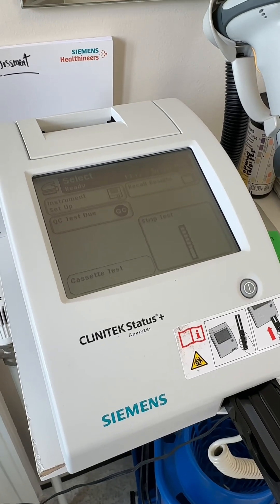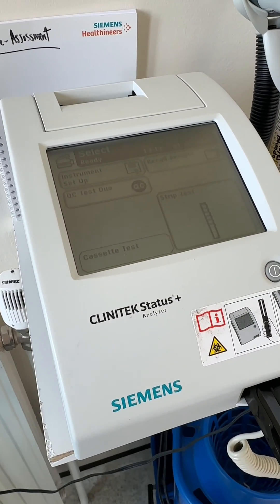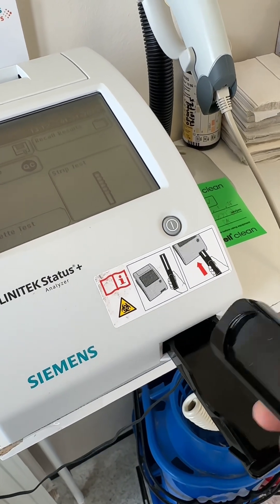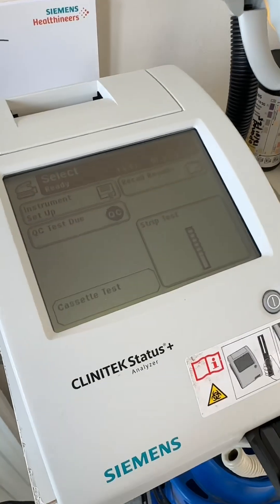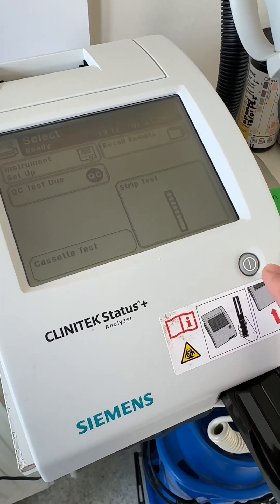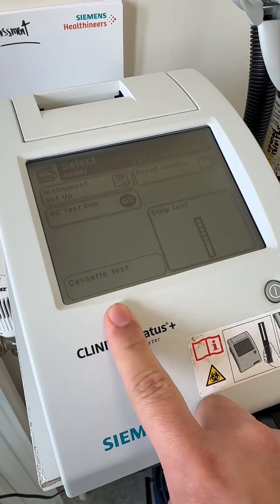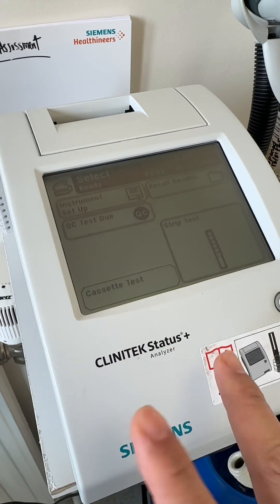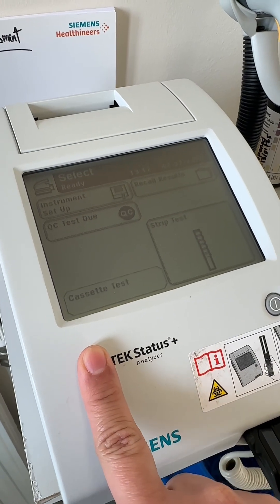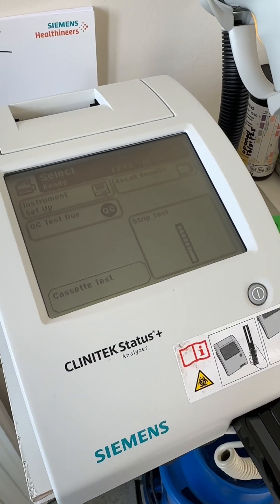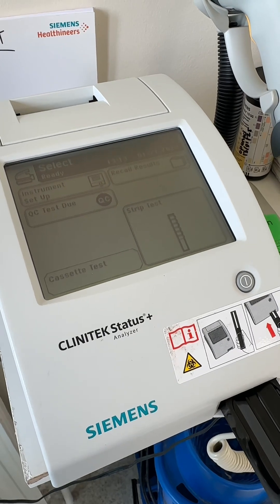We'll go through it step by step. What we have here is a Clinitek Status Plus analyzer. You've got your cartridge — one side for pregnancy and one for urinalysis. Now, not all of you have the cassette test; that's the pregnancy test. For example, here in pre-assessment they only do the urinalysis test. Some other departments like inpatient and outpatient units will also do the pregnancy test.